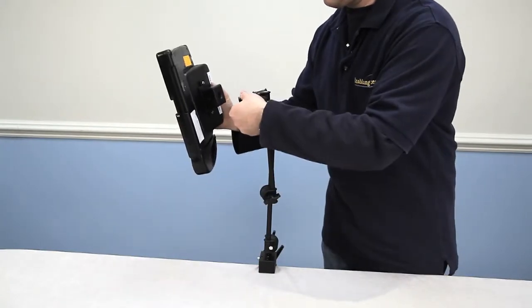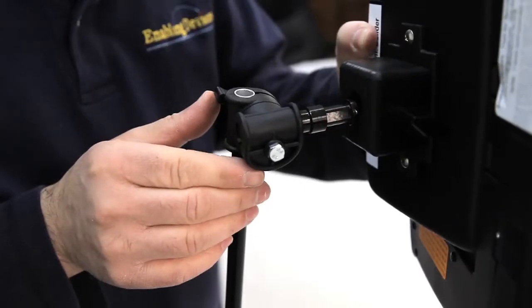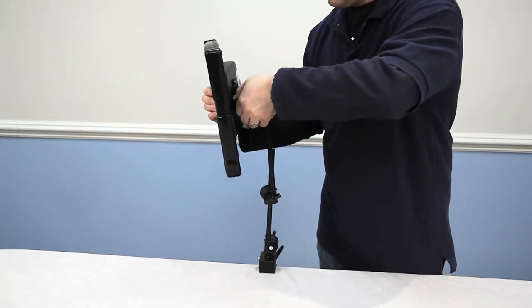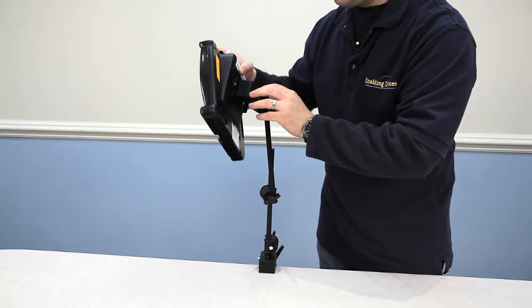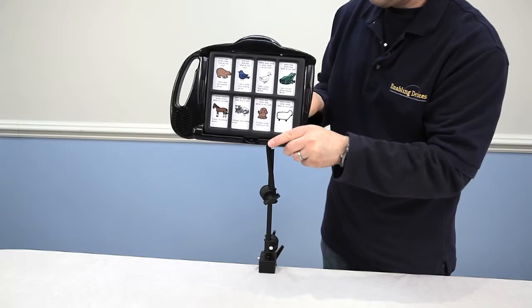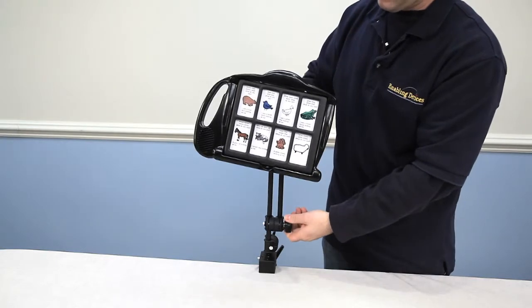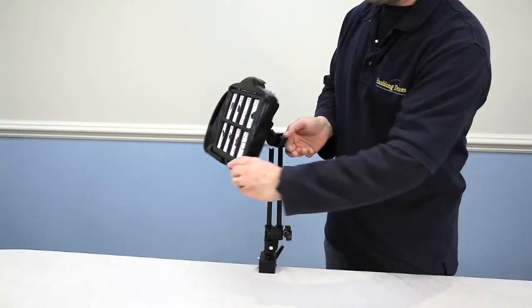I'm going to show you how this goes. Push this all the way on until it goes in all the way, then tighten your set knob. Make sure that this is on tight, and you can orient the device around and tighten it up. As you can see, this arm is extremely flexible and versatile — you can adjust it to different heights, and you have full pivoting ability of the device anywhere you want to go.